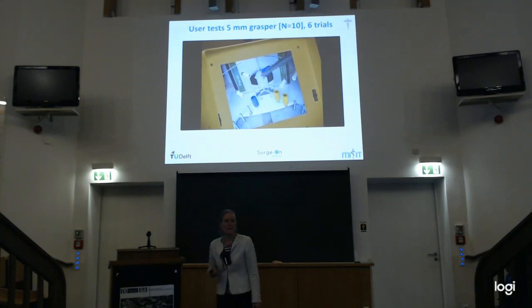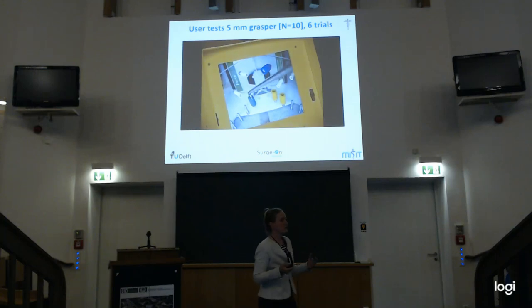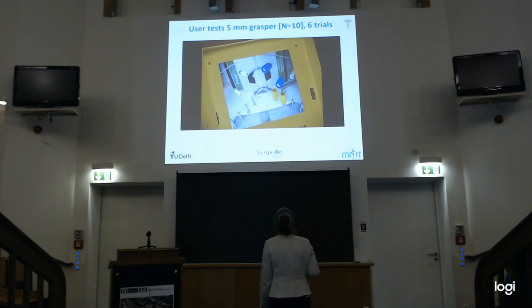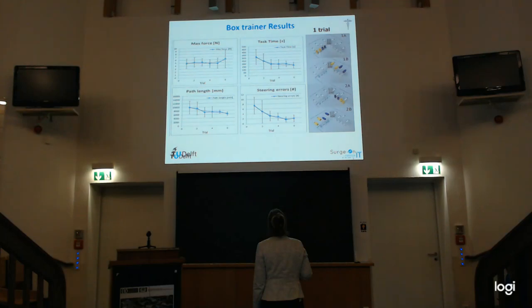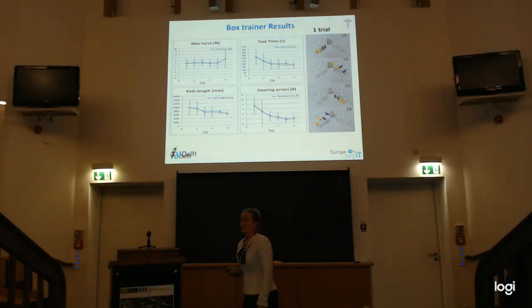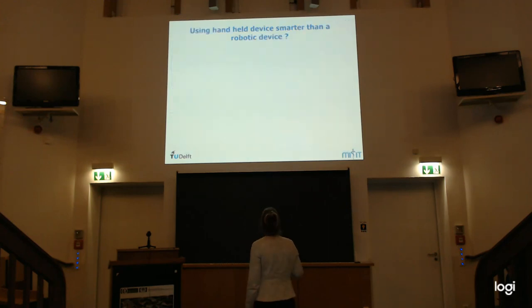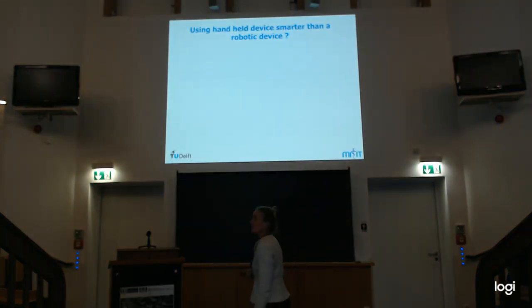And how difficult is it then, and how to handle the file? Because sometimes making the handle is even a bit more difficult than making the tip. Because it makes it intuitive. It's not so easy to determine that. But there are many tests we did, and we saw, okay, in the box tests, it was not so difficult to learn. Of course, it's not as easy as in the animation.